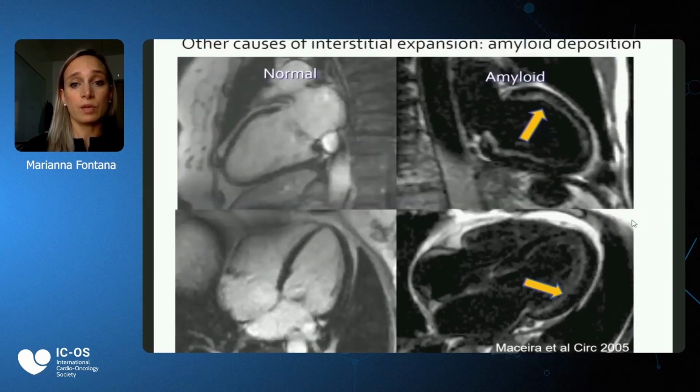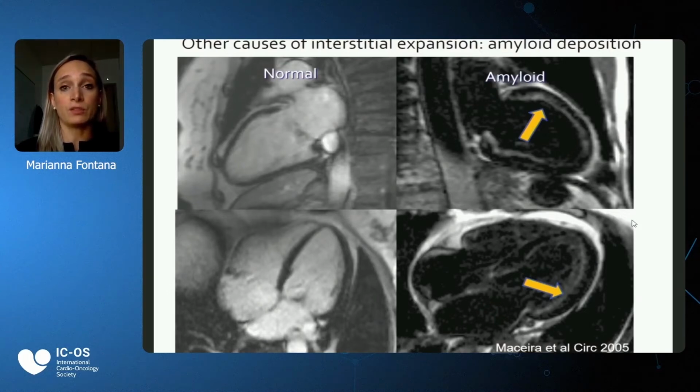And then we learned roughly 15 years ago that after giving contrast to patients with cardiac amyloidosis, we could get pictures that were extremely typical. And these were what we call abnormal kinetics. So the blood was black as opposed to gray, because there was so much amyloid within the myocardium that the contrast was going quickly out of the blood into the myocardium, and then this line of subendocardial or transmural enhancement would appear. And these images were felt to be very typical of cardiac amyloidosis.